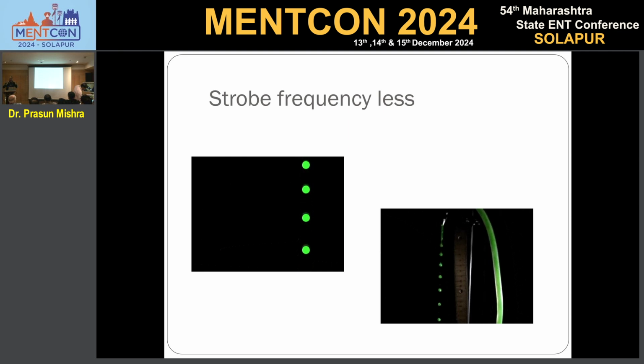If it's a well-lit room, if I throw a fast-moving ping pong ball, it hits down, it hits somewhere, so we will see 1, 2 and maximum 3 points of contact. But if I want to see where all the ping pong ball went up and down while reaching the entire station, I will need some other investigation or some other way of evaluation. So along with the speed of this ping pong ball, there should be a light which is flickering. At the same speed at which the ping pong ball is vibrating, if I have a light which is switching on and off, I would be seeing the movement of the ball in slow motion. Exactly this is required. For example, seeing a fan.